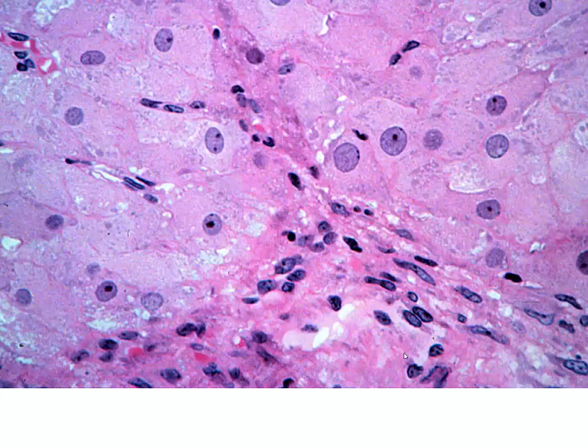And again, just a higher magnification look at the connective tissue septa that we see at the bottom, and then the granulosal lutein cells that are present in the corpus luteum.